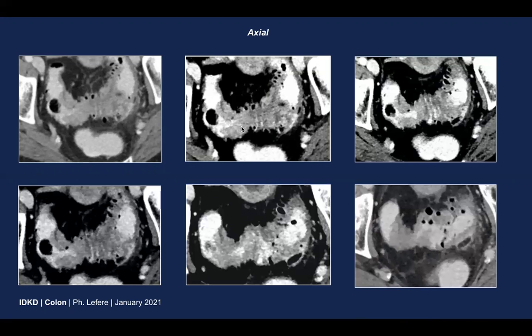Another important feature is to look at the transition zones. In the first proximal zone, there is a more gradual transition to the wall thickening from normal wall — a cone-shaped aspect — whereas in the second part, there is an abrupt transition from normal to pathologic wall thickening. On the other side, we even have overhanging edges: an abrupt transition with projection of the wall thickening onto the normal colonic wall.